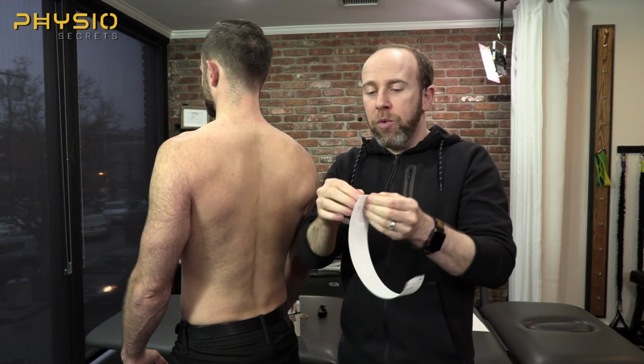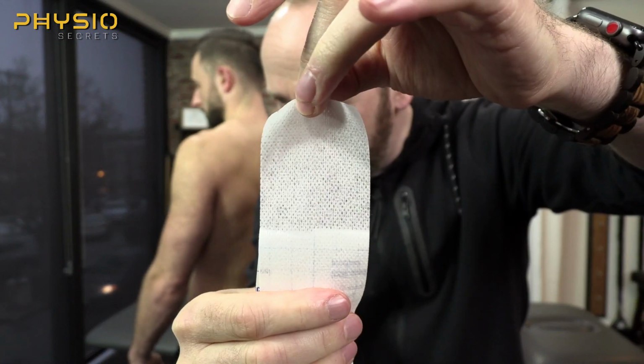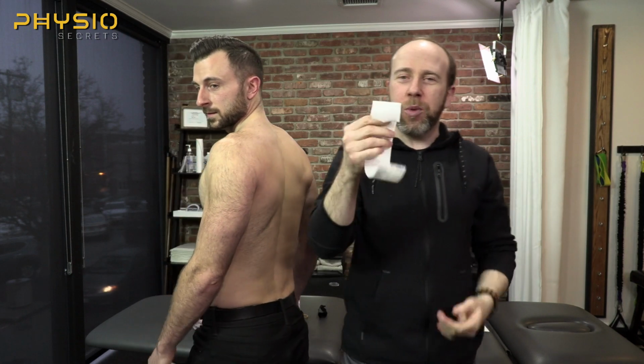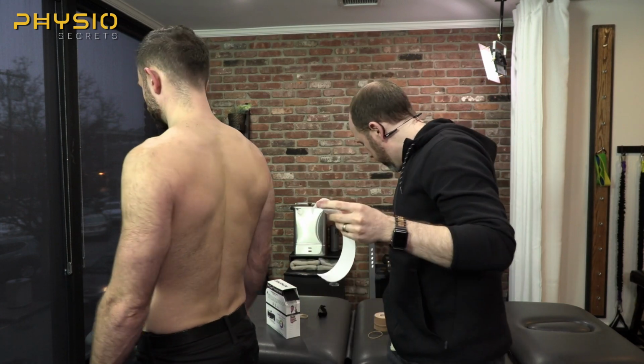Okay. Now, one really cool thing about this tape is that it is porous. There we go. See how it's porous? Now, the reason that's important is because every time he showers with this tape, he will dry. It will dry, and he will not get water trapped under the tape. If you take this and you cover it with this, you trap the water underneath there. That softens the tape up. It stops becoming as rigid, and it wants to fall off.